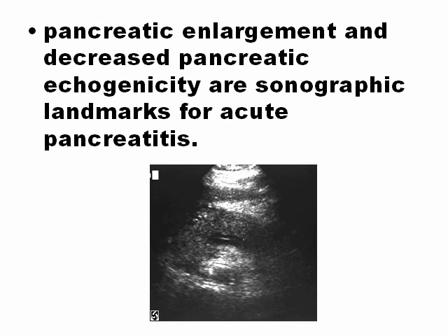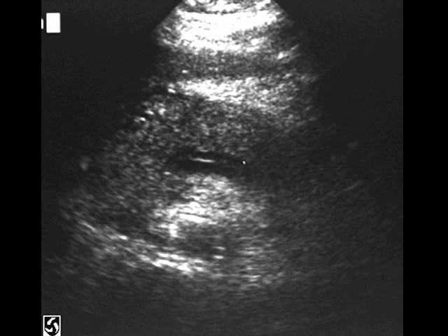Pancreatic enlargement and low echogenicity are the sonographic landmarks for acute pancreatitis. Also free fluid around the pancreas. You can see here another picture of acute pancreatitis with a hypoechoic pancreas. In this picture you can only see the head and the neck of the body, and the pancreas looks hypoechoic.